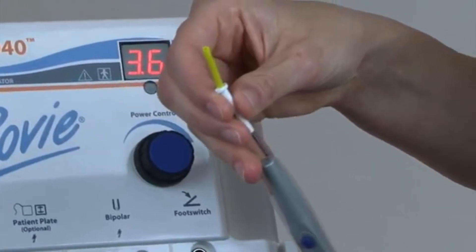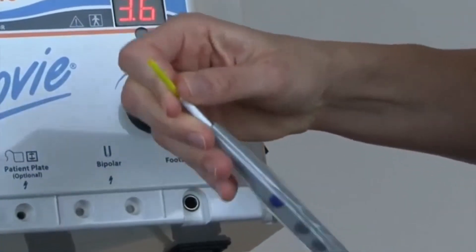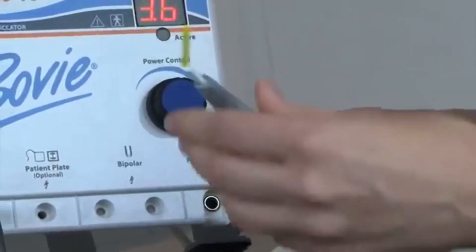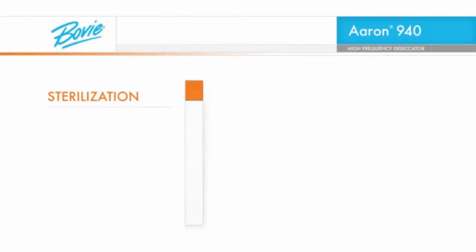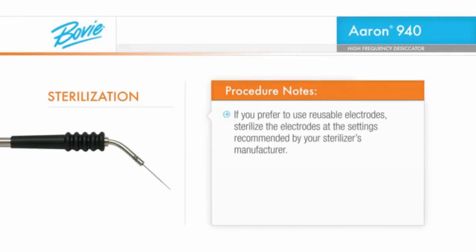We recommend you use disposable electrodes for each patient procedure to avoid cross-contamination. If you prefer to use reusable electrodes, sterilize the electrodes at the setting recommended by your sterilizer's manufacturer.